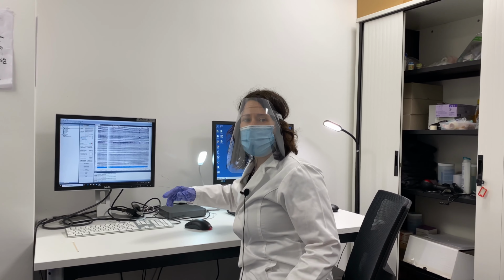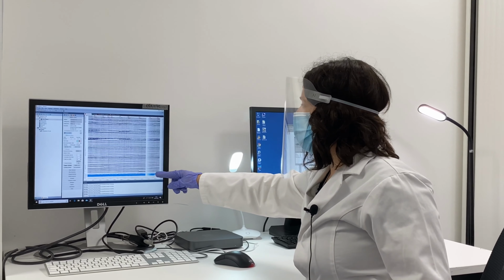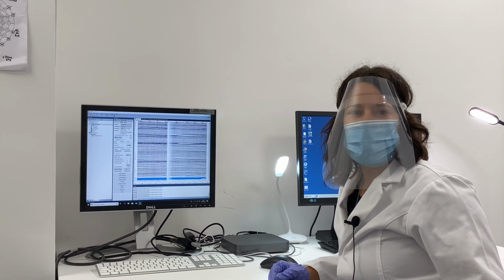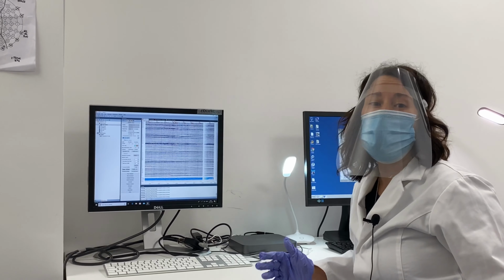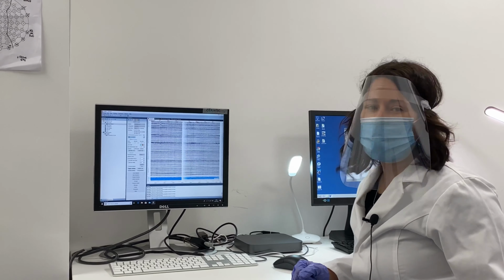Andrew is now performing the auditory oddball task, and we can see here the EEG recording. So now I can always check if we hear the sounds, but also if our participant is performing correctly, or if he is falling asleep, or if he is moving too much. But you can see that our participant is very calm right now.